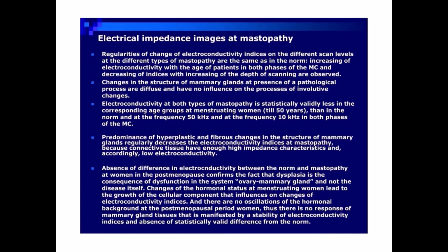Electroconductivity at both types of mastopathy is statistically validly less in the corresponding age groups at menstruating women, till 50 years, than in the norm. And at the frequency 50 kHz, and at the frequency 10 kHz in both phases of the MC.